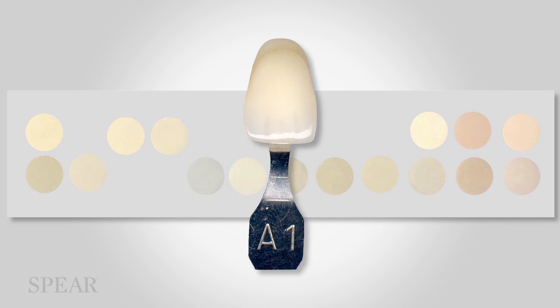All those that you can see on your screen are A1 materials. So you realize that in this example, if you're using the darker shade and you selected A1, your final result is going to be dark. So the lesson here is that not all companies match the Vita shade guide. And that's something very important for us. Later on, you will see that this is one of the reasons why I have a custom shade guide to select the shade when I'm using resin composite. I never use the Vita Pan.